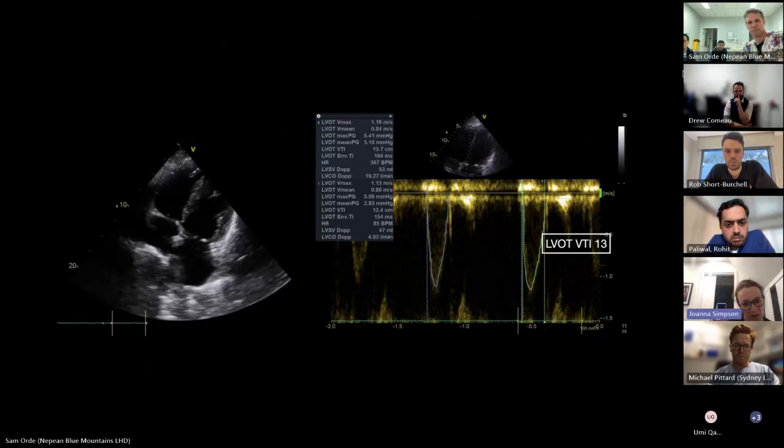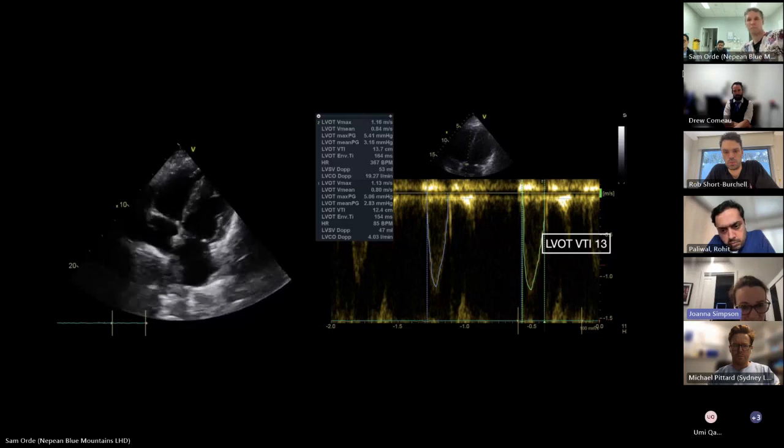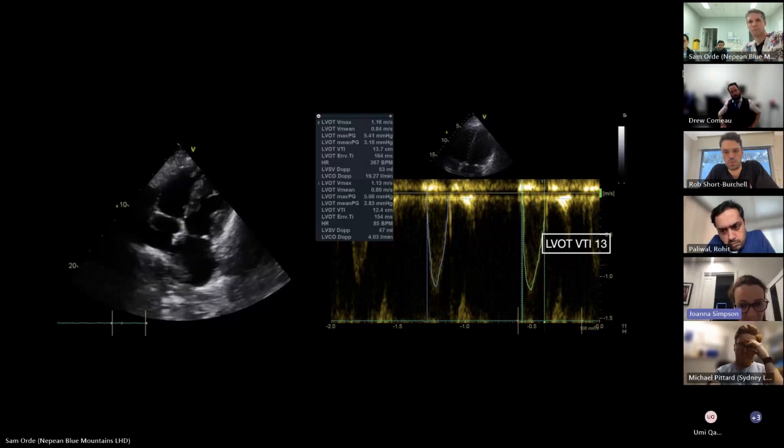I think that's a subcostal. It looks like a cross between either a subcostal or an off-axis apical four-chamber, focusing on the RV, which is again dilated. I can see some septal bounce indicating high RV pressure overload. The RA, it's hard to say whether it's dilated here, but the LA looks like it's dilated, and the LV cavity looks quite small.